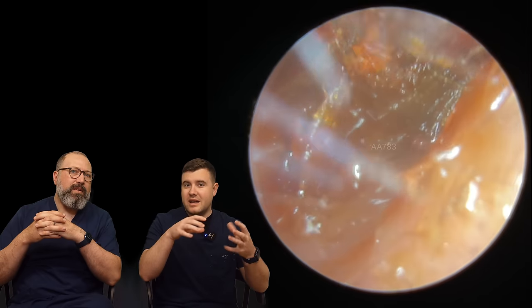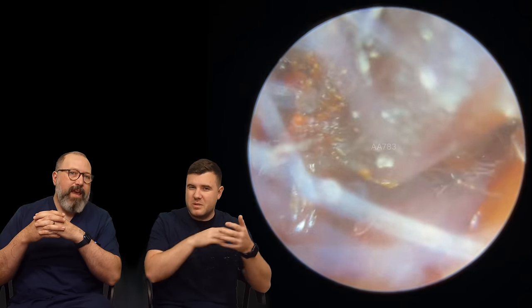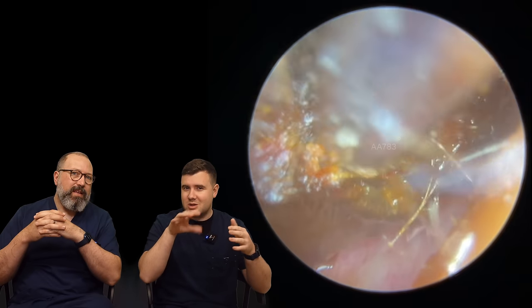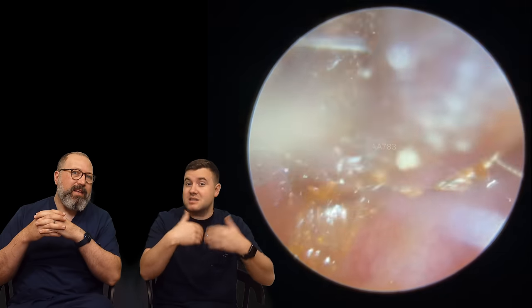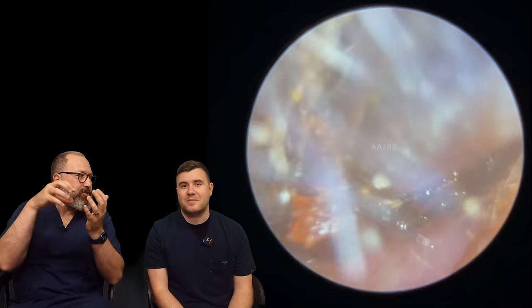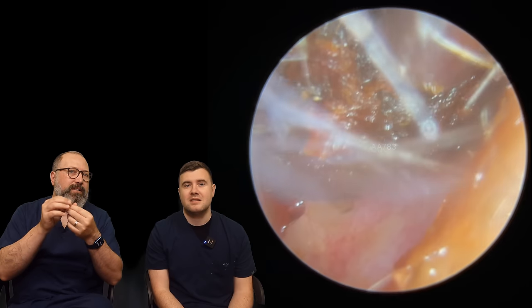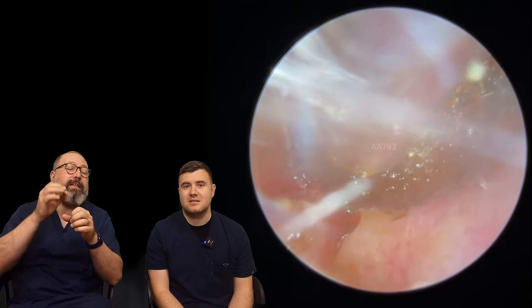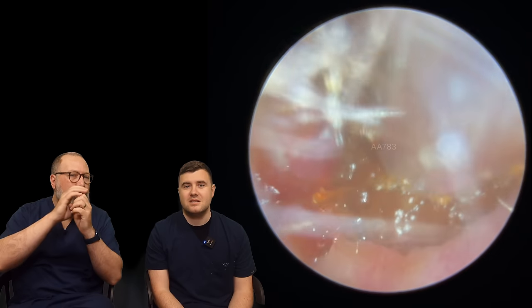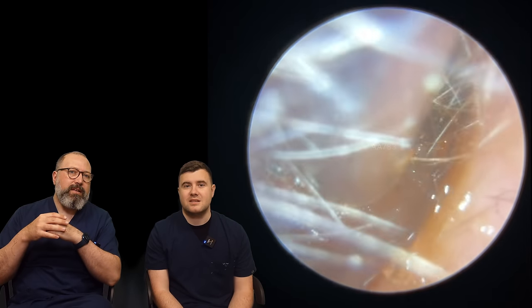With these kinds of plugs, I tend to try and hold the suction on there to just slowly draw it out. With these crumbly ones when we hold the suction on to these little plugs, the pressure builds up and it tends to break a little bit — or what you'll find is it takes almost like a perfect punch out of the wax and it blocks the suction. Then you go and try and flush that through, or you've got little tube clearers — basically little plastic things like a pipe cleaner you can push through to clear the debris. But it's coming away well here — we're just getting a little bit of a wiggle, and that's where the olive oil is going to come in handy.